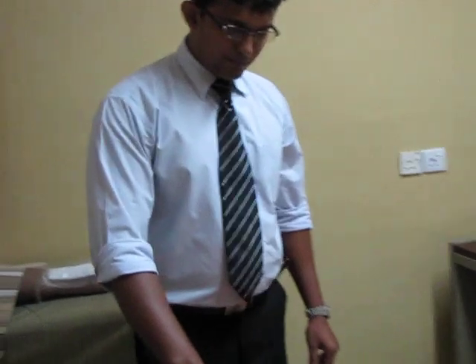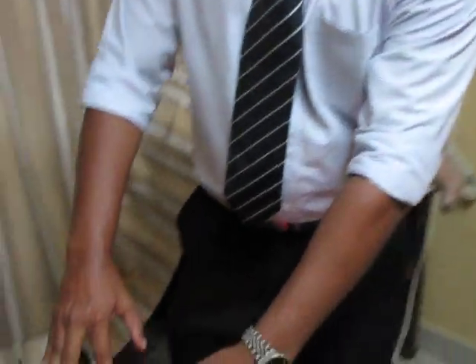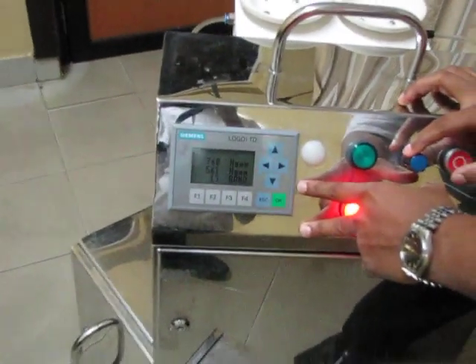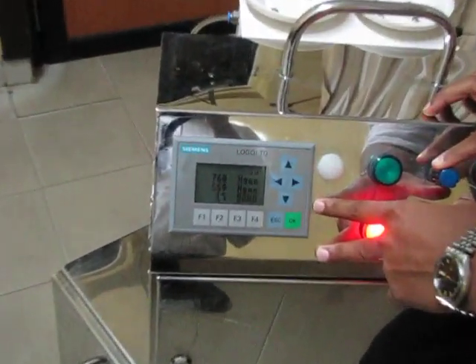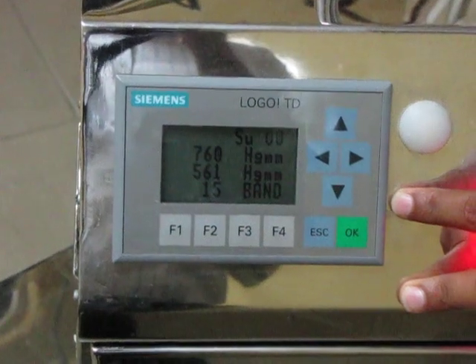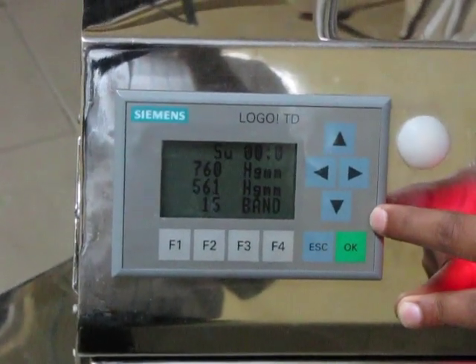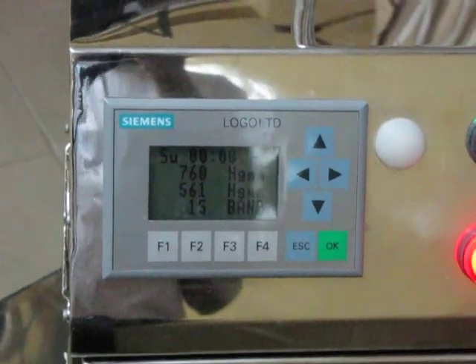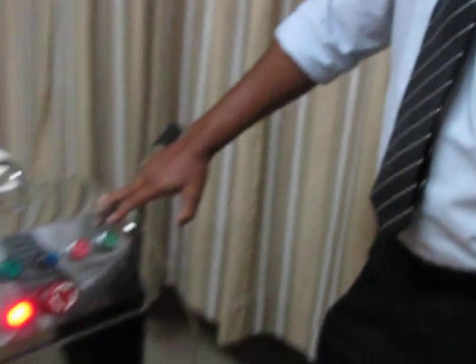Now I will set the pressure to 560 millimeters of mercury, which will bring about minus 200 millimeters of mercury on the wound bed in comparison to the atmospheric pressure. Now I will turn on the machine by pressing the screen.